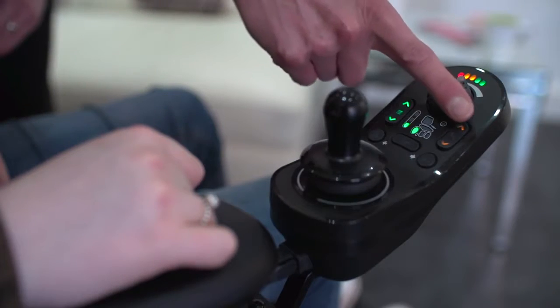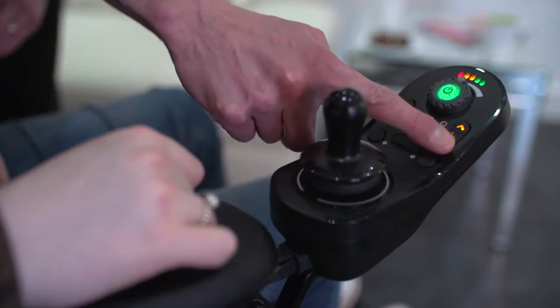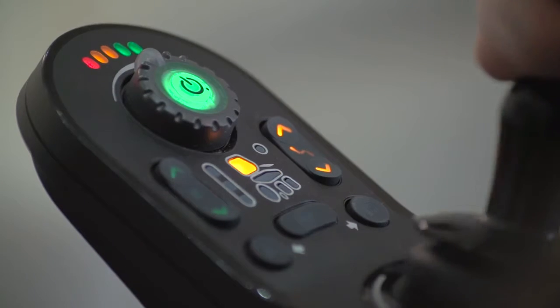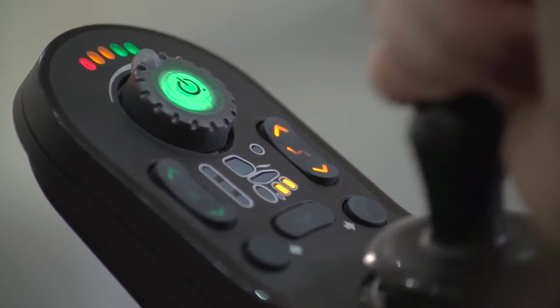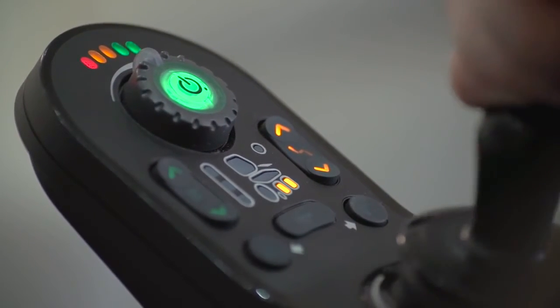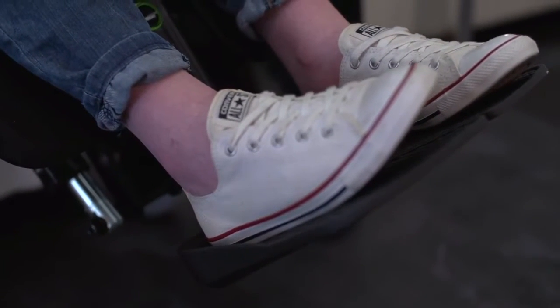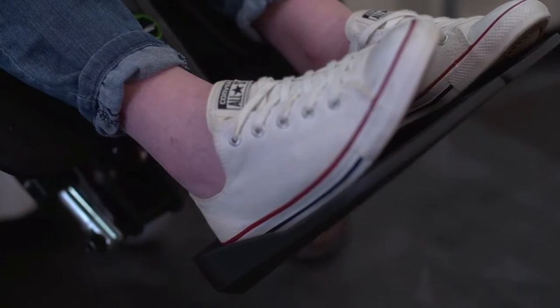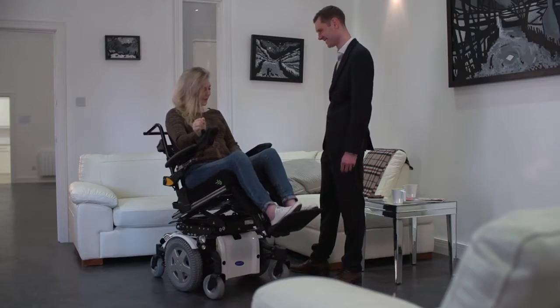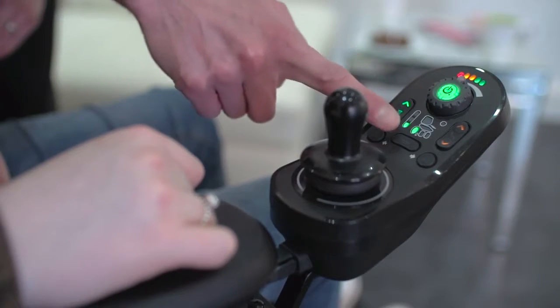The seat buttons can be accessed via the simple seat button. Seat functions can be programmed to be displayed in a set pattern or last used method, whichever is preferred. Simply press the seat function button and then left or right joystick movements selects the seat function, whilst the forward-backwards joystick movement extends or retracts that particular function. The movement is proportional to the joystick deflection, meaning the further the joystick is pushed, the faster the movement. To exit out of seating mode, simply click on the drive button which will highlight the drive function button.